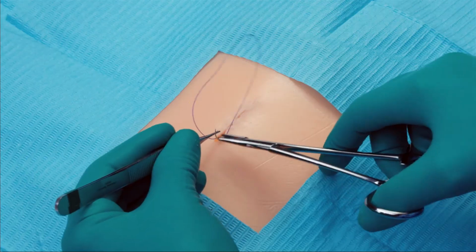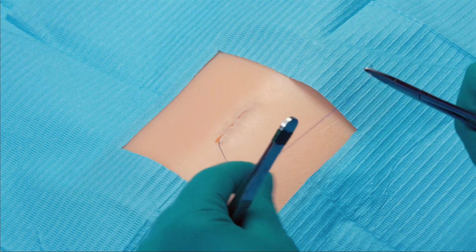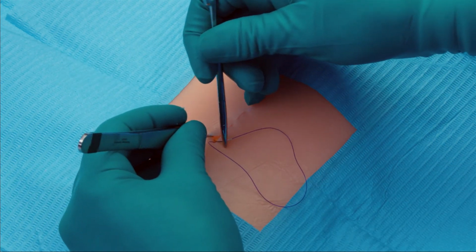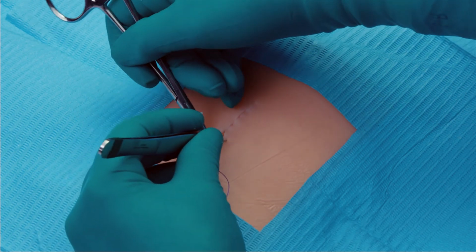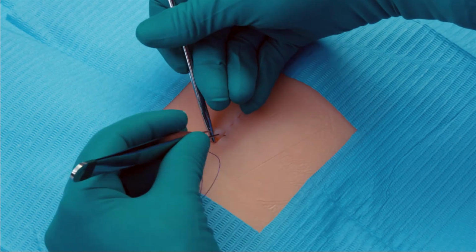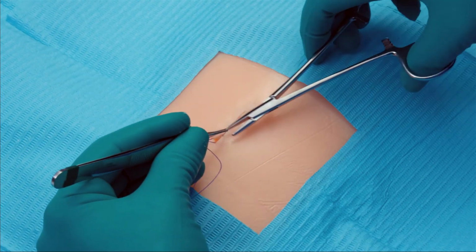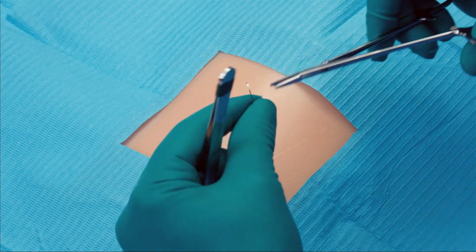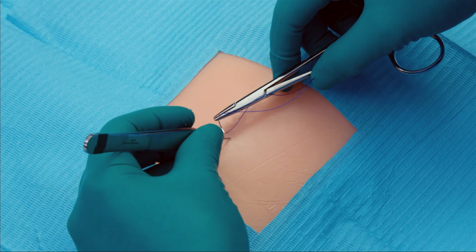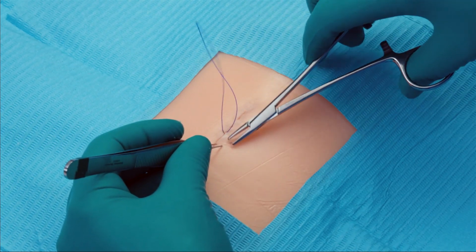I'm coming to the very end here. Come out, and then I'm going to do the reverse. Once the apex has been reached, make the appropriate backstitch towards the midline of the incision. Once the back stitch is complete, simply exit lateral to the incision, coming out of the superficial skin, and then cut flush.